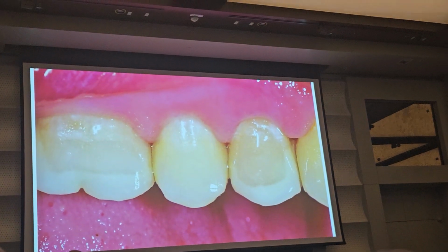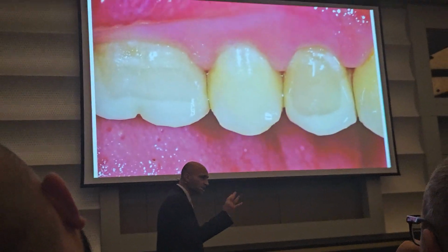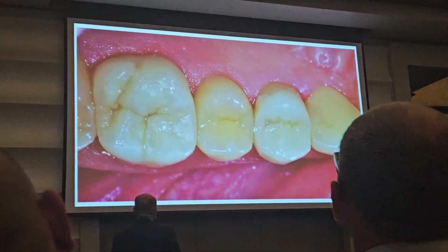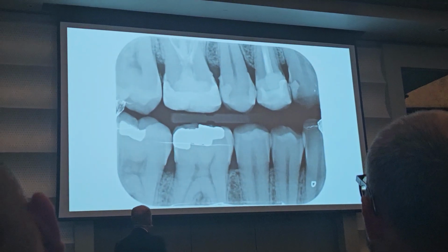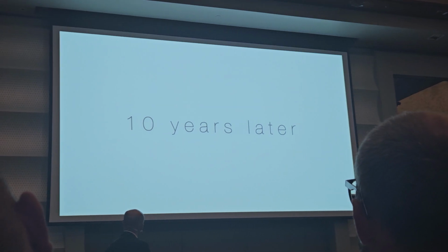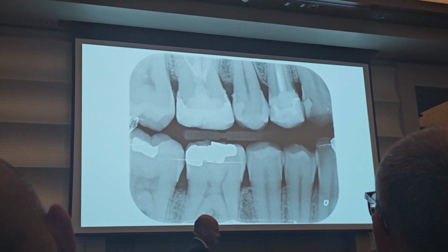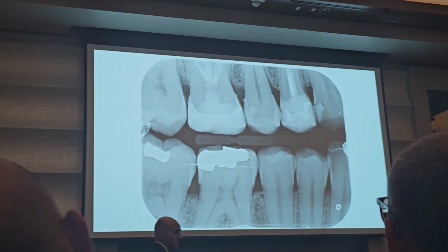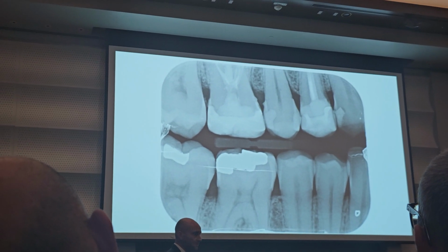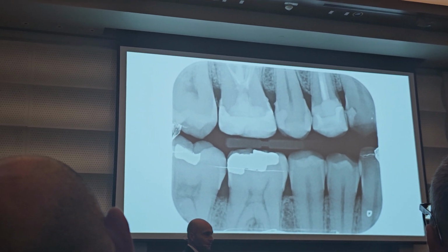Okay, this is the post-op result. You can see the double color. This is the problem even with the ceramic colors in root canal treated teeth. But then, you can see how much excess cement I get. So I spent 1 hour just cleaning those excesses. And when you use ceramic, at least you can use the blade. But if you use the blade against the composite onlay, you crack even the onlay of composite, so it's even worse.